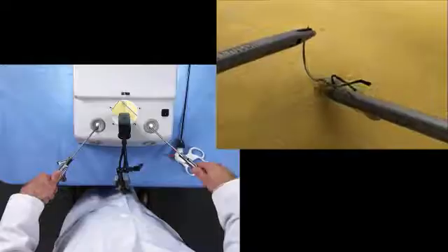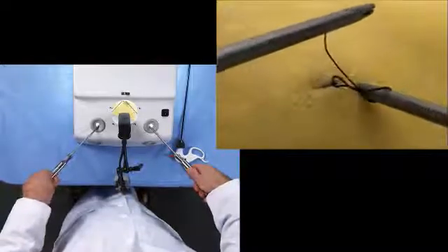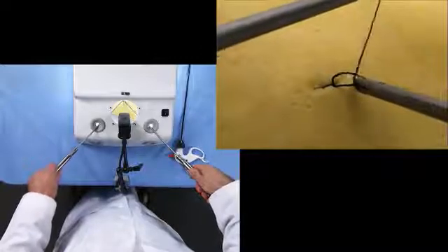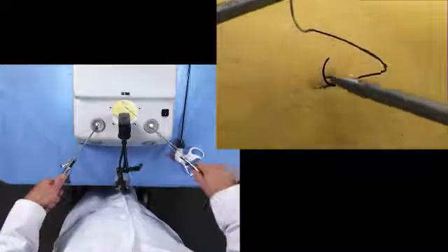We'll make a clockwise rotation, grasp the tag, rotate our hand medially 90 degrees, move the right hand to 7 o'clock and we've completed the knot.